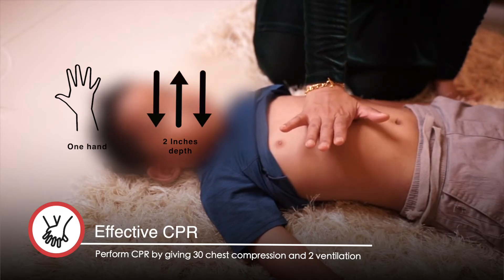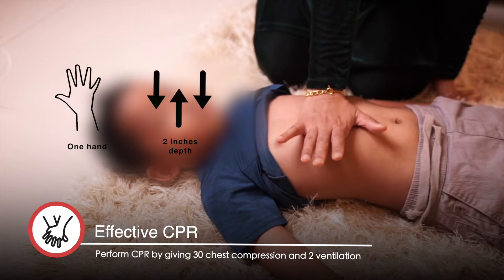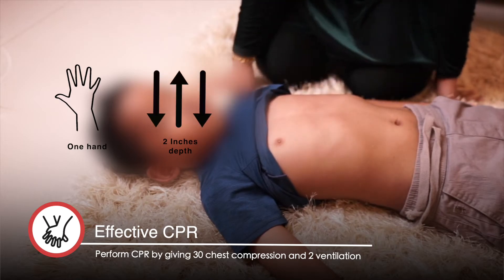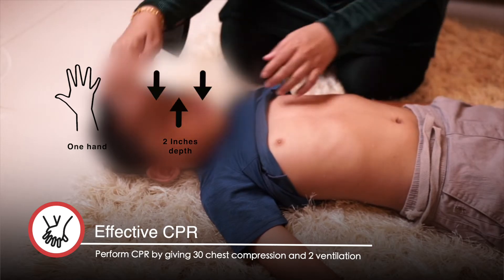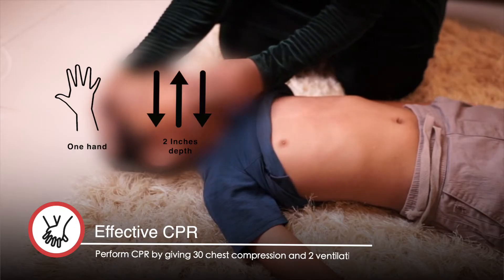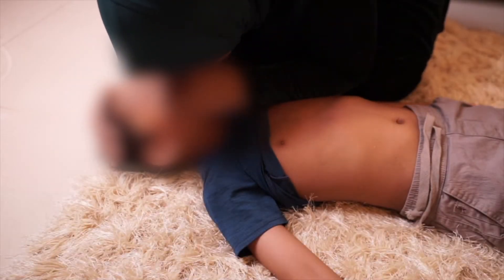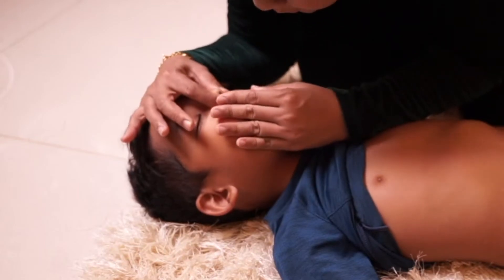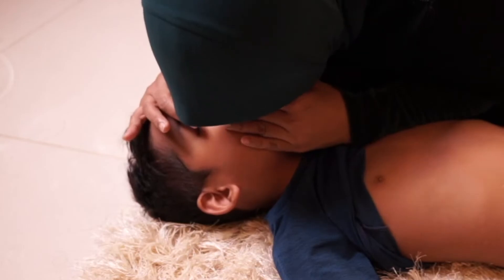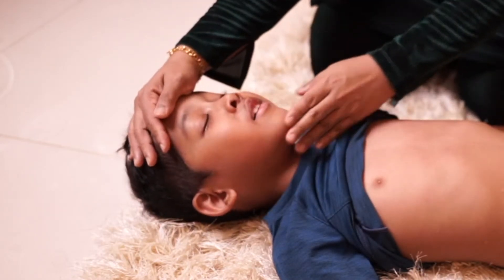To do this, place the heel of one hand in the center of the child's bare chest. Perform 30 chest compressions, pressing down to around one-third of the depth of the chest. Alternate 30 chest compressions with two rescue breaths, but only if you know how to do them.